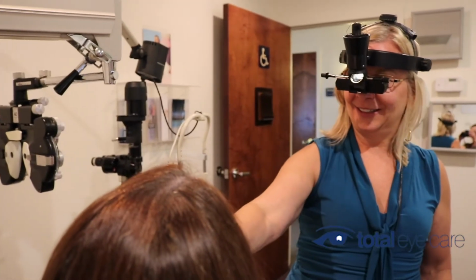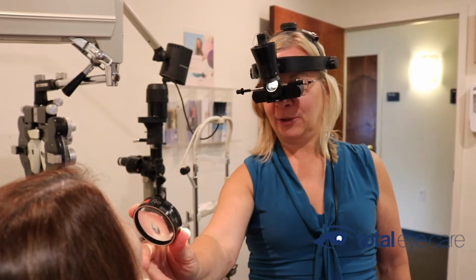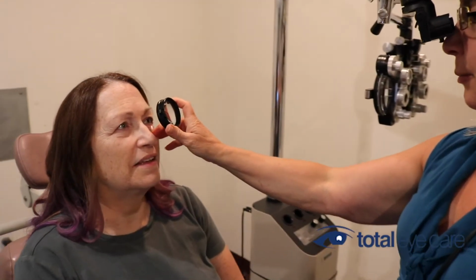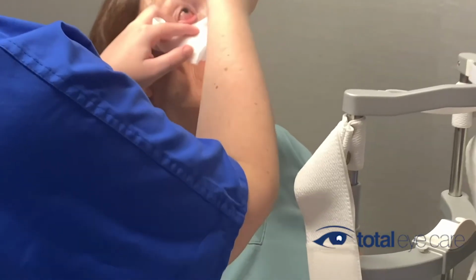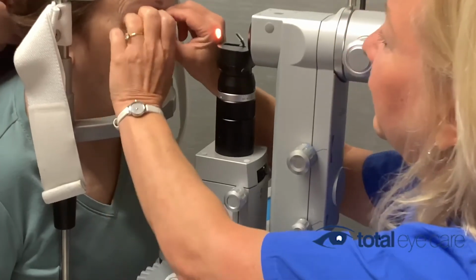First, the patient will come in for an evaluation to assure the floater is treatable. Not all floaters are treatable depending on the size and the extent of the floater, but many floaters are treatable. Following evaluation, we document the floater and then we schedule the procedure. The procedure that day involves topical numbing drops in the eye. We put a lens on the eye to magnify the floater.